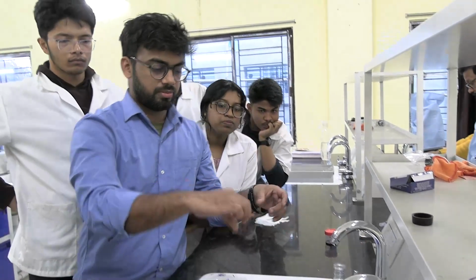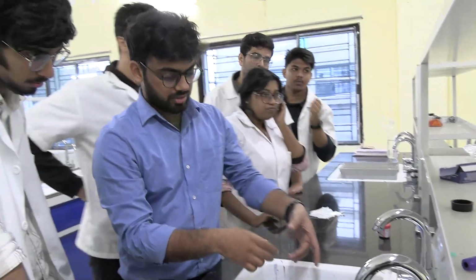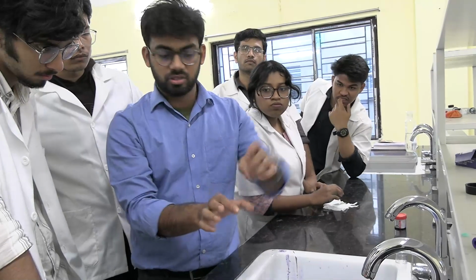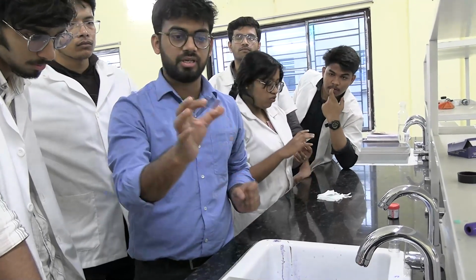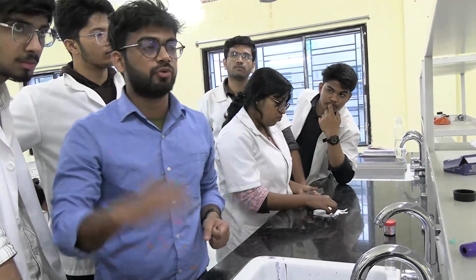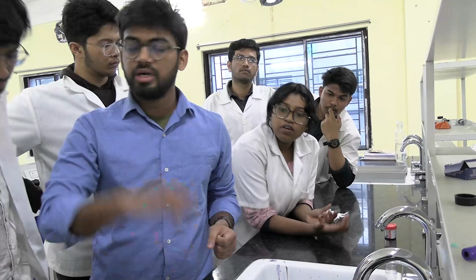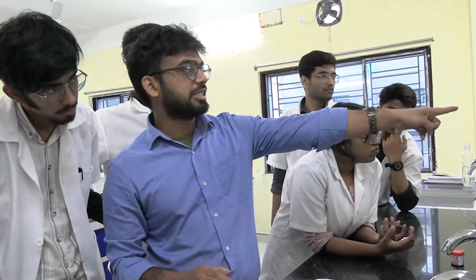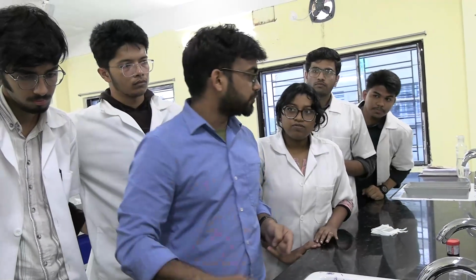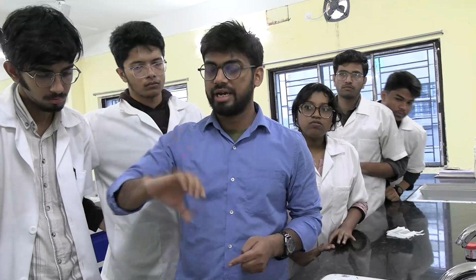Now I'm going to place it here. Now again. Always touch like this. Never touch like this or like this. Touch like this only, and continue until it becomes complete. Then you're going to focus under the microscope: first low power, then 40x, then oil immersion. In oil immersion only you're going to find the different types of WBCs. I will be sitting here and showing you how the cells are visible under the microscope at 100x. But first of all, one of you needs to dry it.